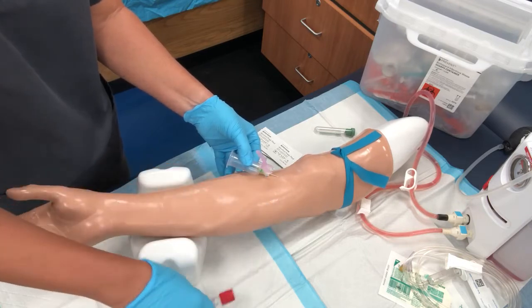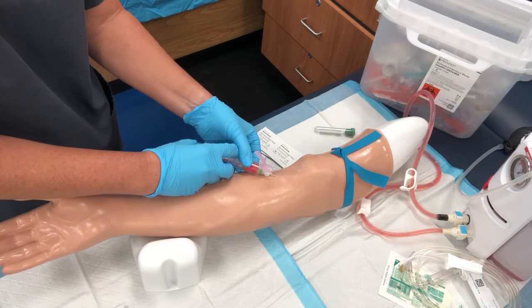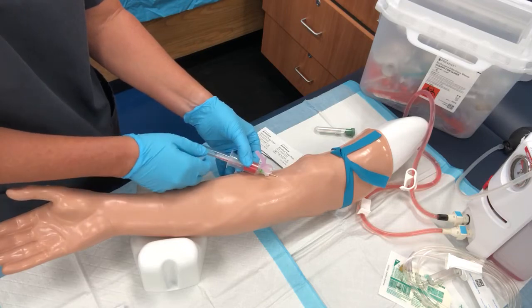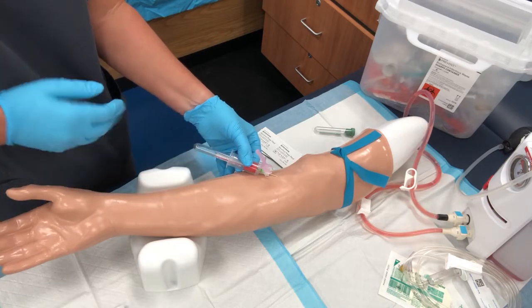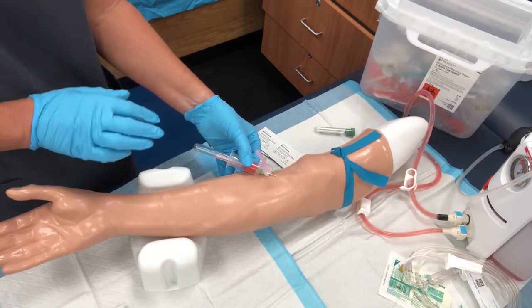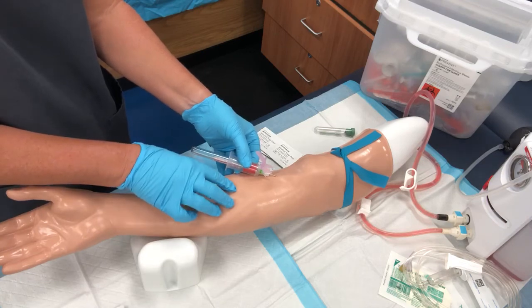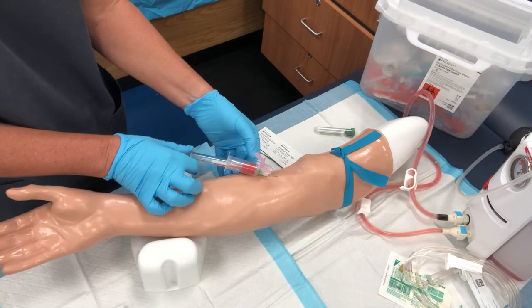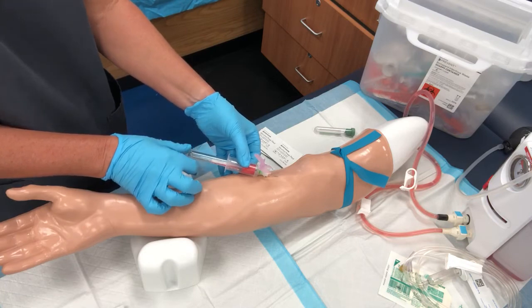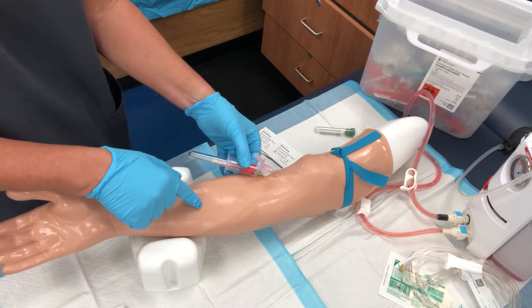I think that should be about it. Grab your vacutainer, the moment of truth. Well, that was air. So it looks like I went through and through on the vein. Now, if this happens to you and you didn't get anything, you can't just readjust. On a patient, you could actually readjust. Okay, now I readjusted and I've got some fluid there, okay? On this, you cannot, because this is not real. It only has air in it.